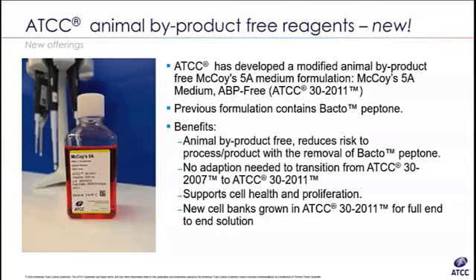In addition to the contamination being difficult to truly get rid of, there may be changes to the cells through the stress of the contamination and subsequent curing with antibiotics. It's better to go back to a clean bank if you have that available. All right, good.